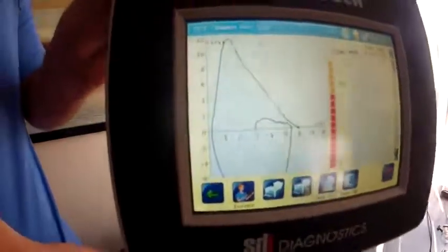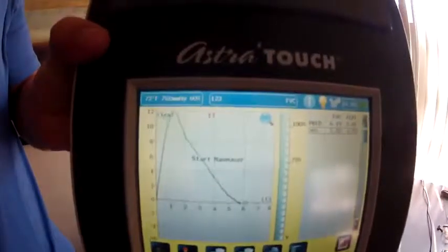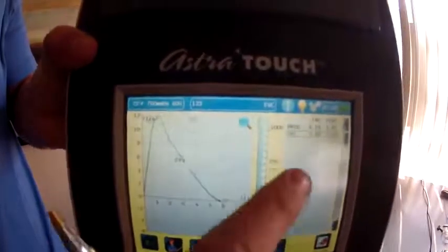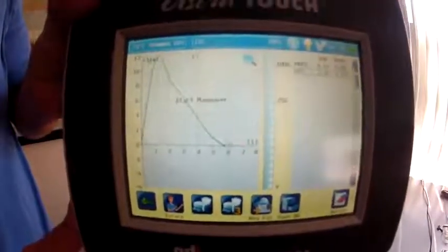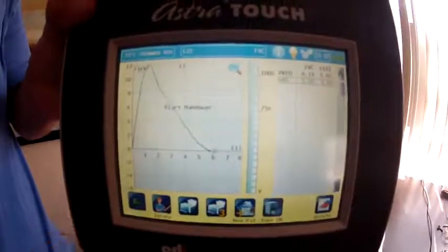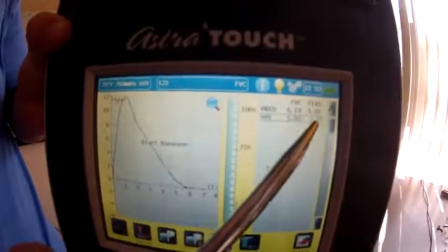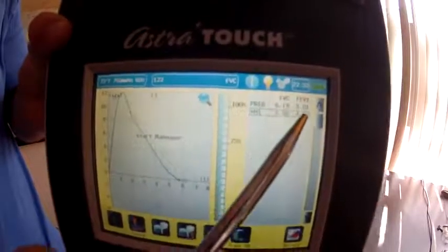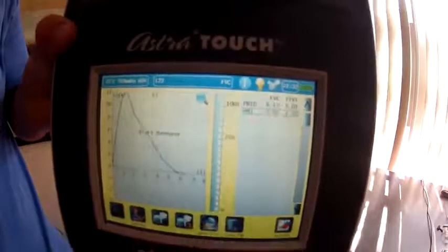Now it's done — it showed you the test. Over on the right you're going to see maneuver one. You can keep going with more maneuvers if you want, but I'm going to go ahead and just do one. It shows over here on this side maneuver one — this is the FVC and the FEV1. Above is the predicted value, so I'm slightly under on both of those, but not by a lot.